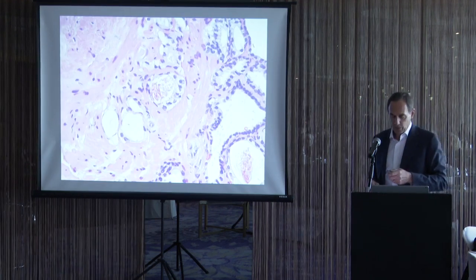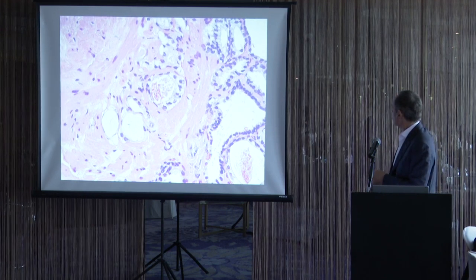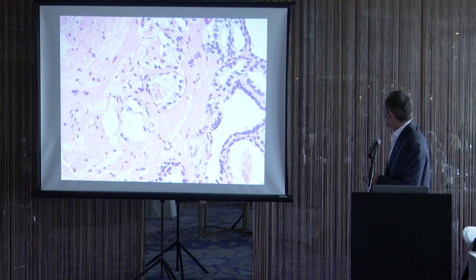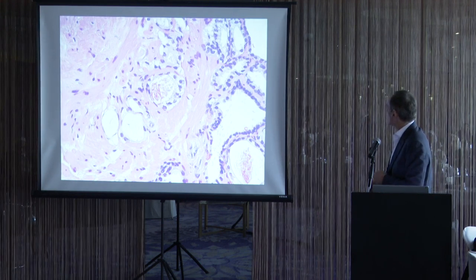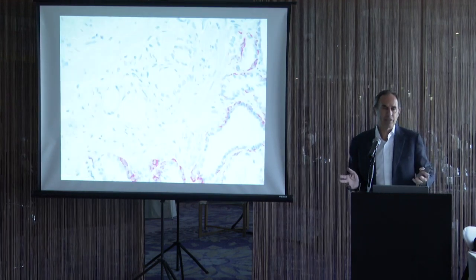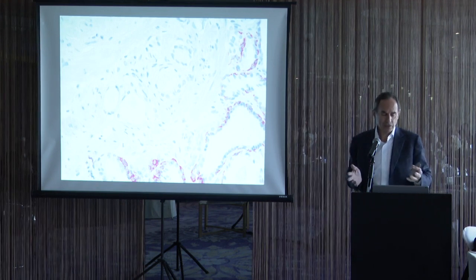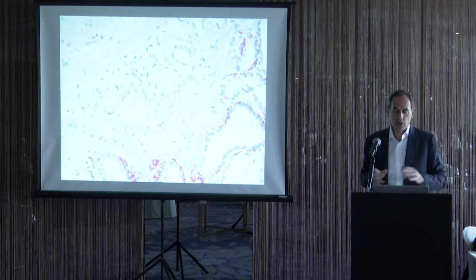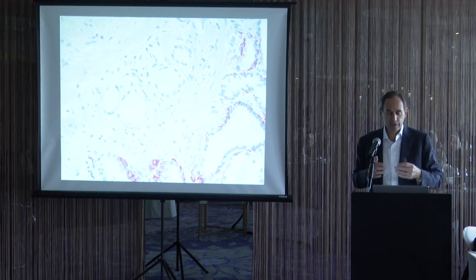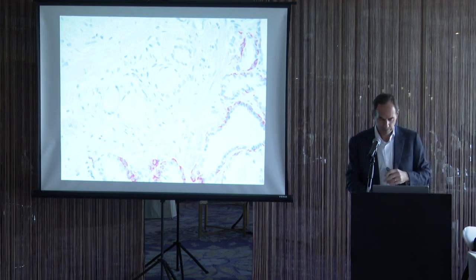This would be a case that I would call atypical. At lower power, it's very atrophic. The glands are small and crowded. Could be partial atrophy, but nuclei a little bit more atypical, some little crystalloids. I'm not sure. And they're totally negative for basal cells. Now again, if this was a classic partial atrophy, negative for basal cells, I would call it partial atrophy. But because it's not typical partial atrophy, but it's still atrophic, I would call this atypical. Suspicious for cancer, cannot rule out atrophy.